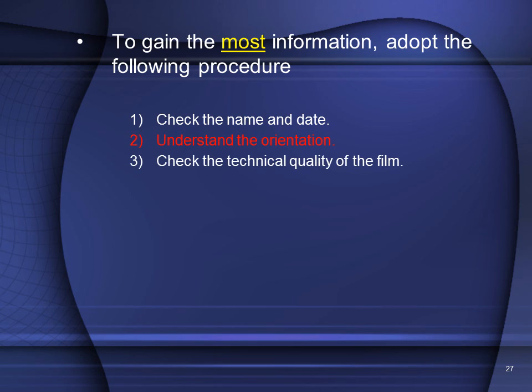Then you want to check the technical quality of the film. For the most part, this will be done by the radiographer. Some of this might be done by a radiologist, but it's important for you to know how to check the technical quality of a film, so that you have some basic working knowledge that will assist you in knowing that the interpretation you are making is accurate for diagnosis of your patient.